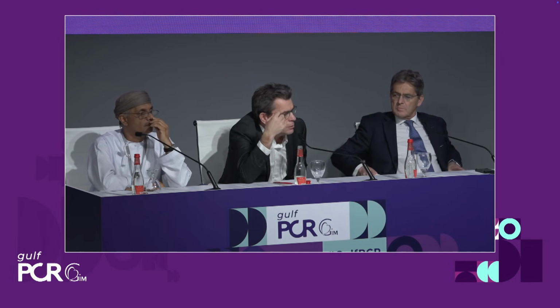You know, that jury, I guess, is going to be a very controversial one, isn't it? Upfront fracture versus post-fracture? No, it's more that you need to decide if you fracture or not, because if you fracture, you can actually implant a one size larger valve. Yes, you would need a larger valve. But mostly you do the fracturing after implantation, but you have to decide on the valve choice before you initiate the procedure. Right, that's what you're saying.